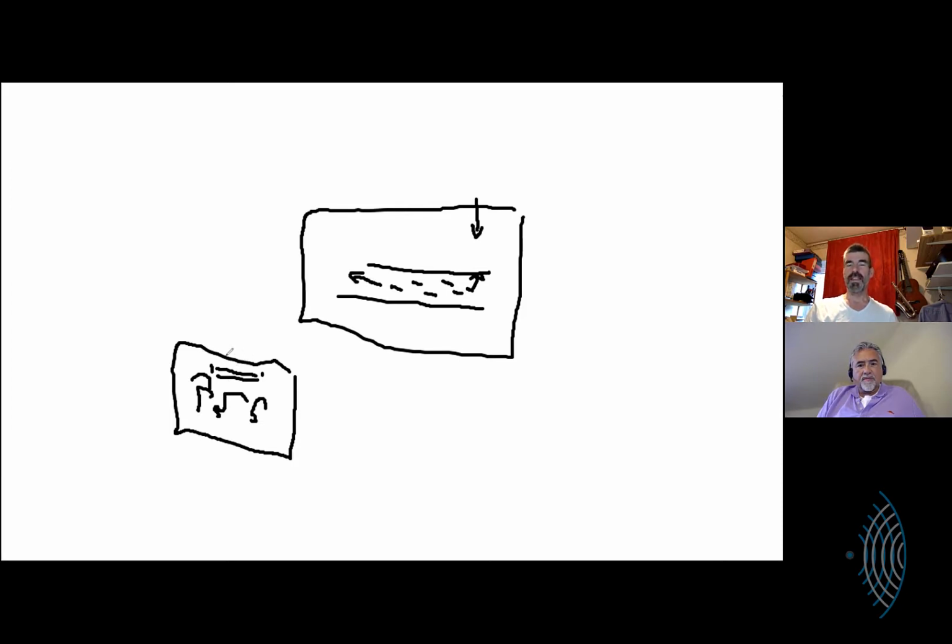If you aren't worried about these tiny movements relative to the probe, which you pick up with the power Doppler, you can increase your sensitivity to pick up the easy to pick up flow that is always passing in these windy structures in the microvascularity. There are always sections of it that are actually easy to pick up. And to pick up the really small ones, you need to turn the gain, the sensitivity, up very high. But you don't have to do it as high, because you don't get as much noise with the color, because the color is looking only for these vessels.